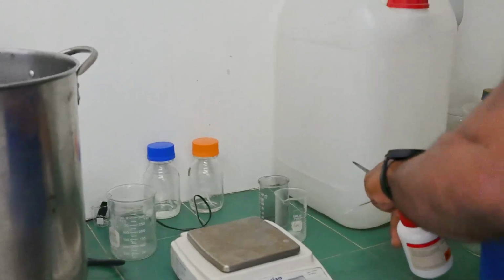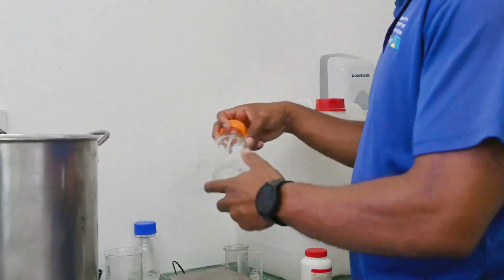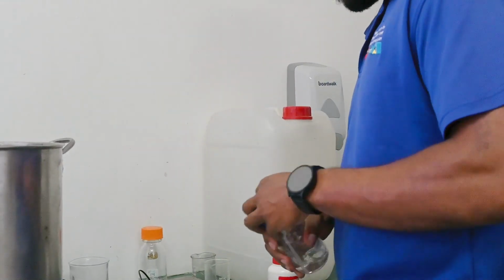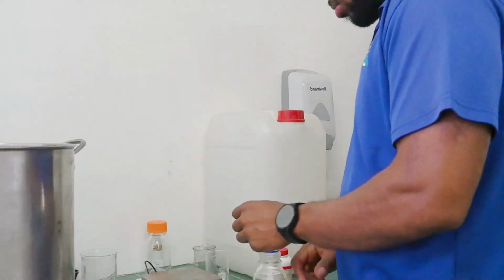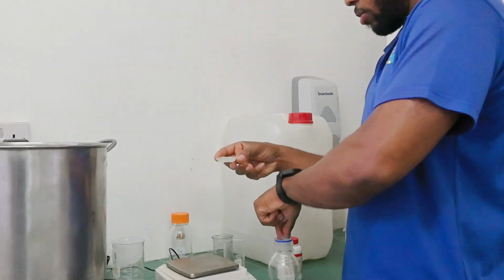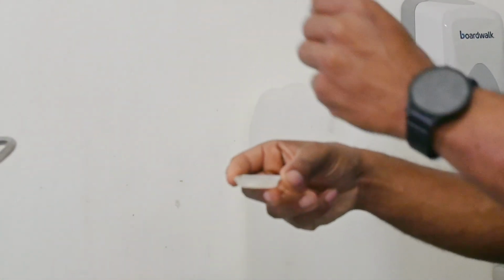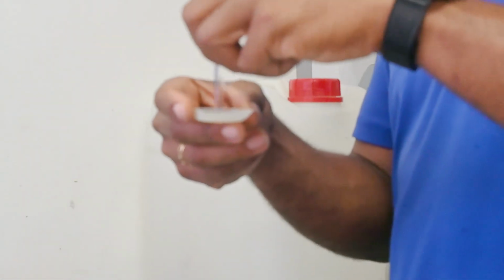Then we're going to dissolve it in sodium hydroxide. A few drops of sodium hydroxide. Dissolve it with a glass rod.